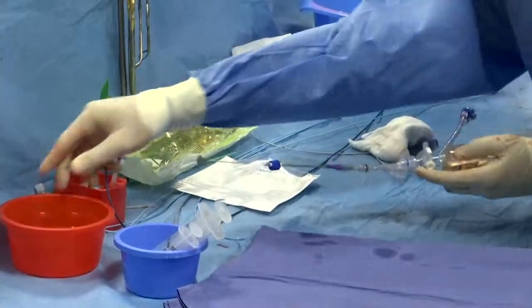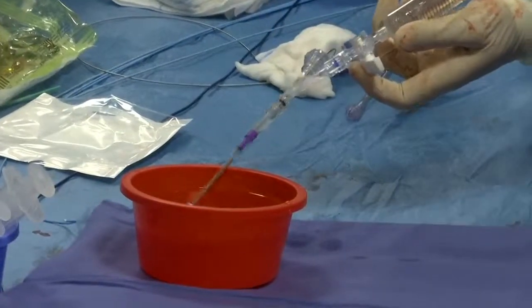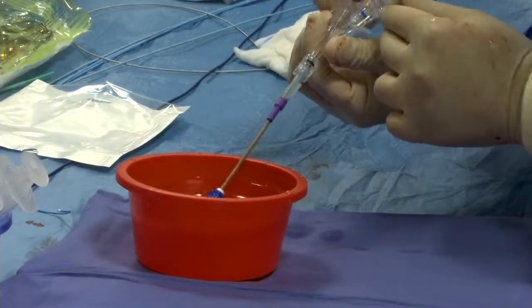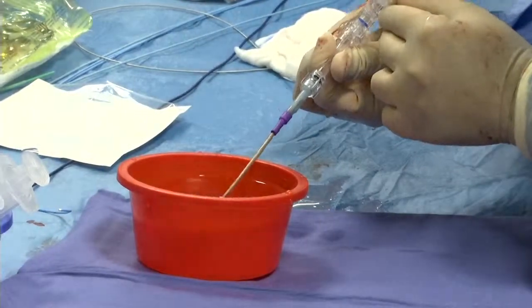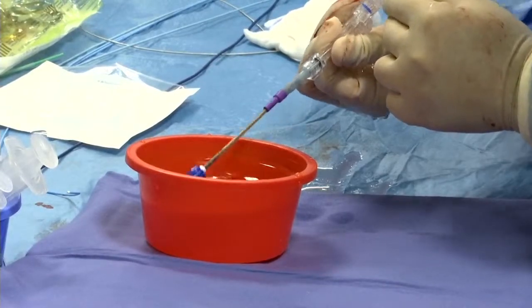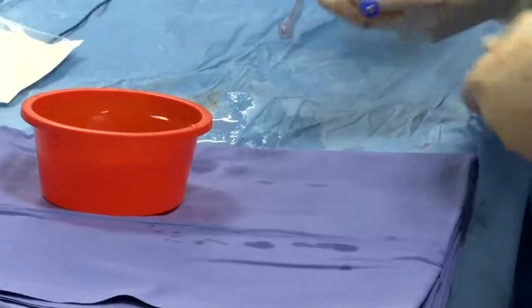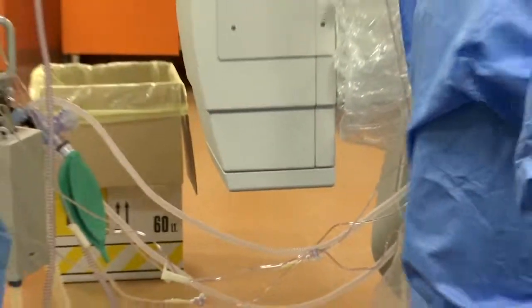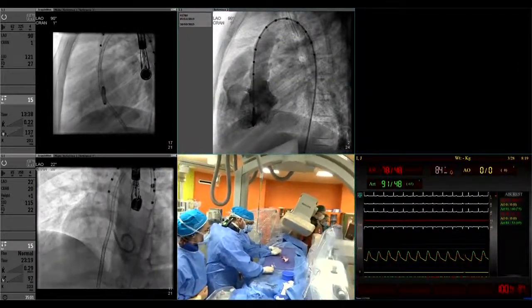Of course, you have to take care not to catch the tricuspid valve, but I think Tin demonstrated very nicely when you should not proceed and when the wire is entangled within the tricuspid valve, and then he changed the strategy, used a pigtail, the wire went to the PAs. So I think you could go either way here. I don't see any problem using a double disc device here.